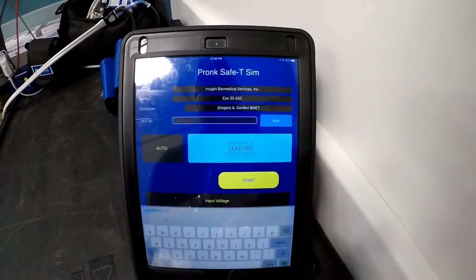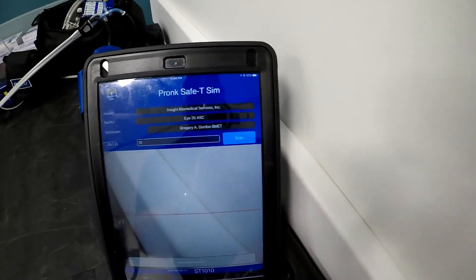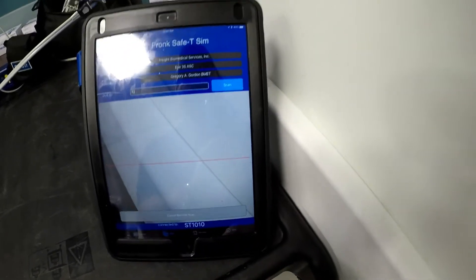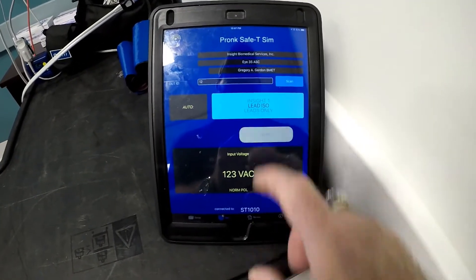Simply punch in the device under test number manually, or you can scan — it activates the device's camera and you can scan the barcode, but we'll cancel that. And we'll select lead isolation, and we'll start.